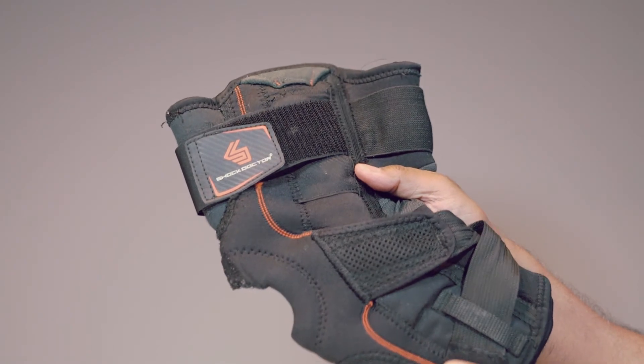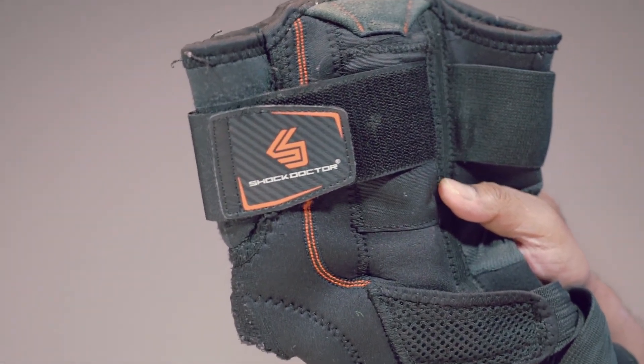Overall, a great product if you ever need support for your knees. Highly recommended.